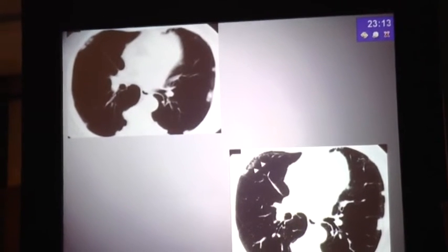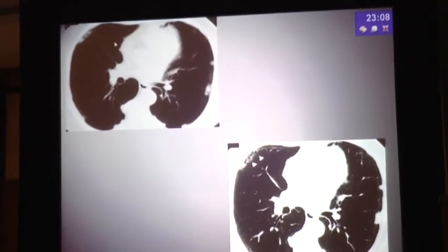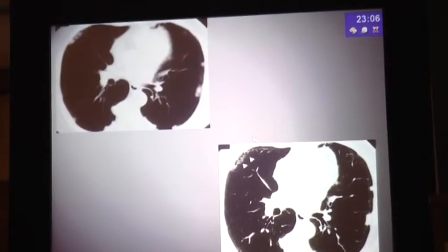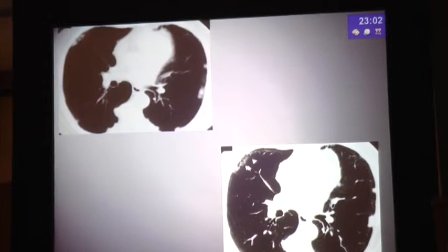So here is an example. We can see these blotches very well. But what are these blotches actually? This is actually a thickened interstitium. And this means something. This information will tell us whether the patient is suffering from interstitial lung disease or just simply consolidation.